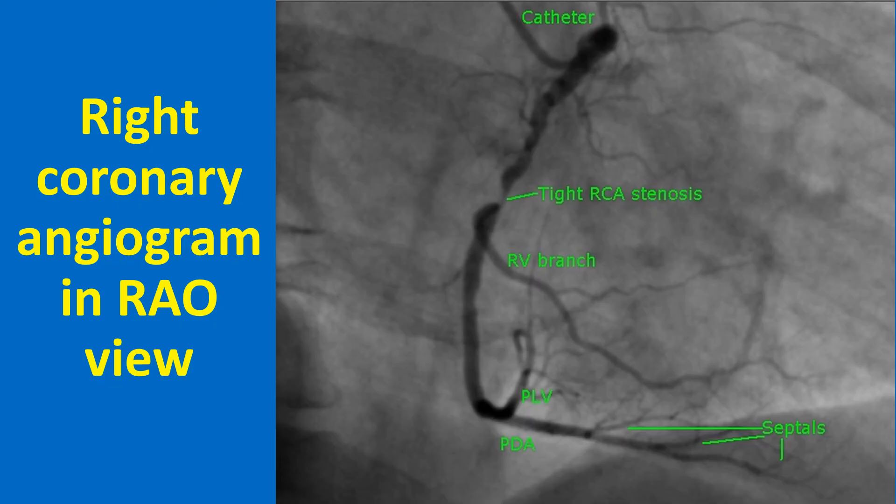In another right coronary angiogram in RAO view, septal branches of the PDA and PLV are seen well. The RAO view shows the proximal part of the right coronary artery in a vertical line, with the spine seen on the right side. A tight stenosis is seen just before the origin of the right ventricular branch.